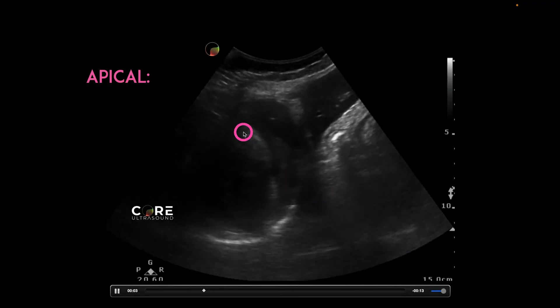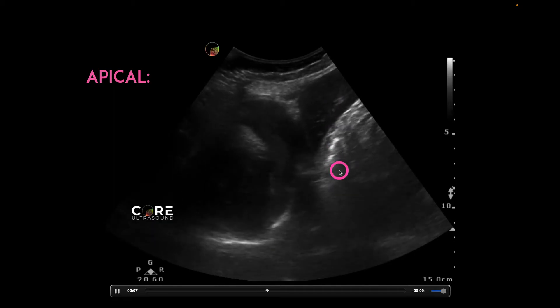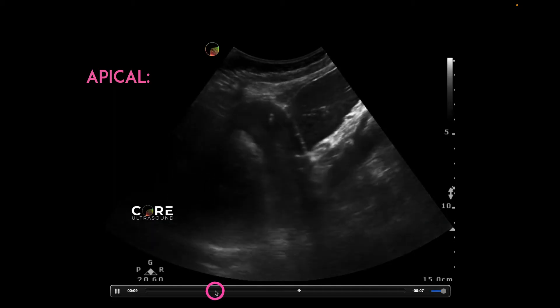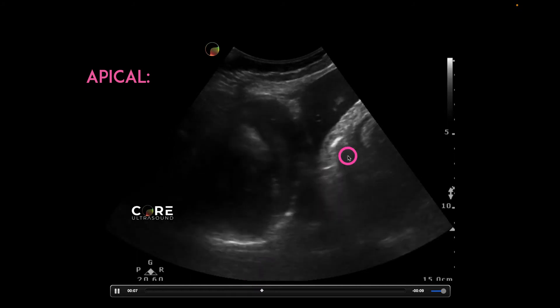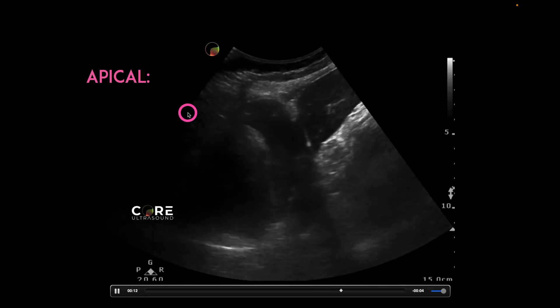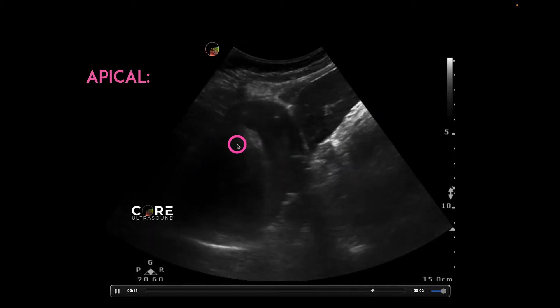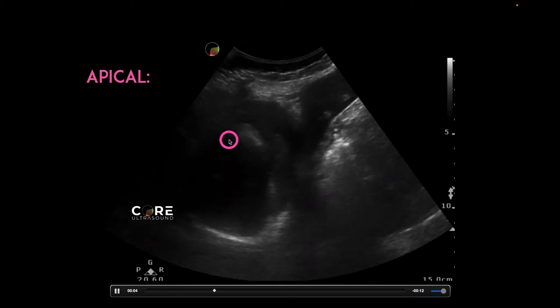This is an apical four-chamber view. This is the heart, a little bit of the liver — that left lobe of the liver — and we're actually seeing a bit of the aorta right there, and we're seeing that needle go into that pericardium right there. I could have and should have decreased the depth, but this was a successful pericardiocentesis without any harm done to the heart.